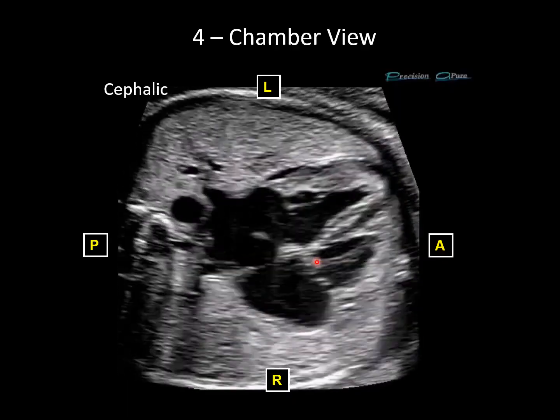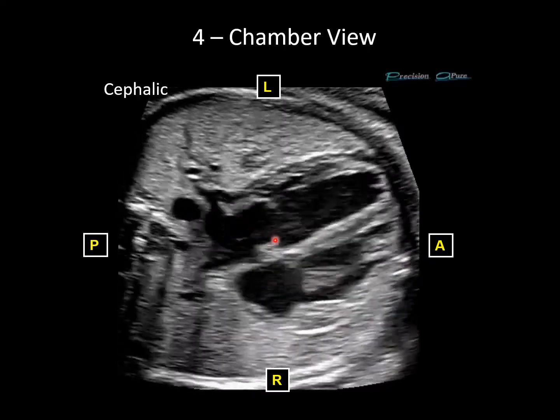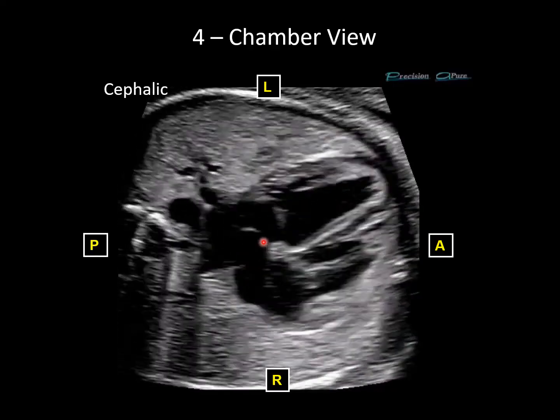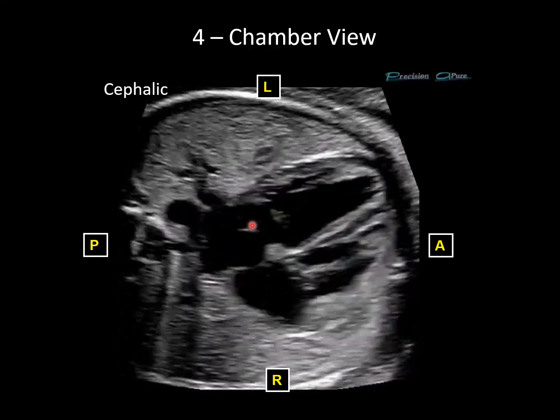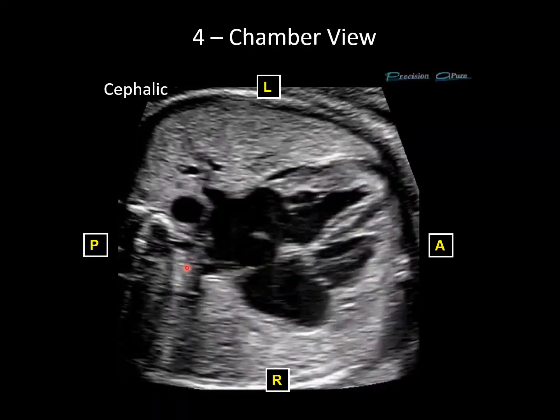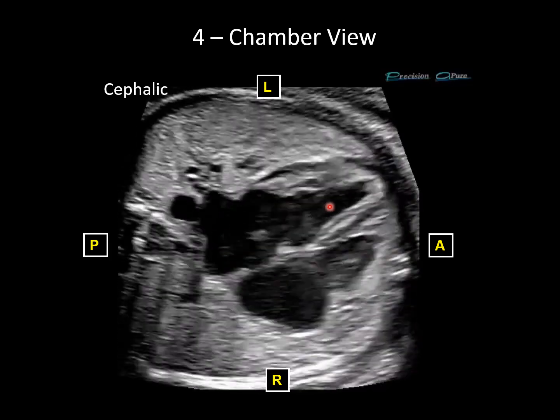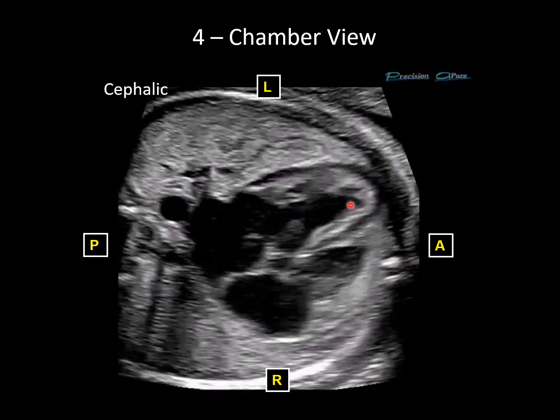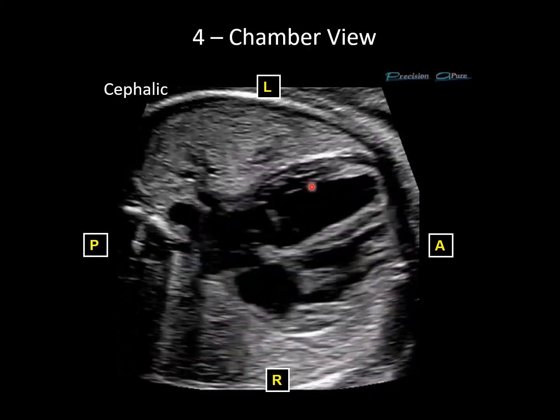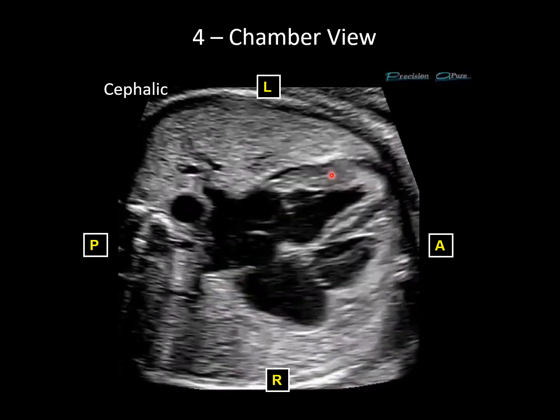Some septal attachments of the tricuspid valve here. The foramen ovale, the flap of the foramen, should be bowing into the left atrium a third to a half of the way into the left atrium. That's a normal appearance. You have pulmonary veins draining here into the left atrium. This left atrium connects to the morphologic left ventricle. Again, smooth-walled, no septal attachments from the mitral valve. Papillary muscles here along the free wall, except the chordal attachments from the mitral valve.